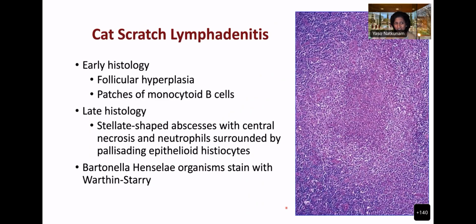So this is another infectious disease, again from a cat, that can have microabscesses. This tends to have neutrophils, so it can be separated, and there's also organisms that you can bring out using special stains. And we don't see leprosy very often, you do. So that is something that if we see it, then it gets shown around to everybody. So that's a very good answer as well.